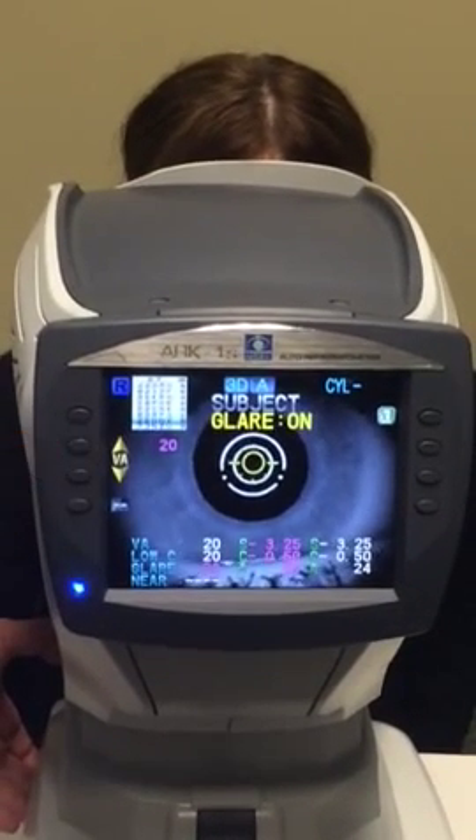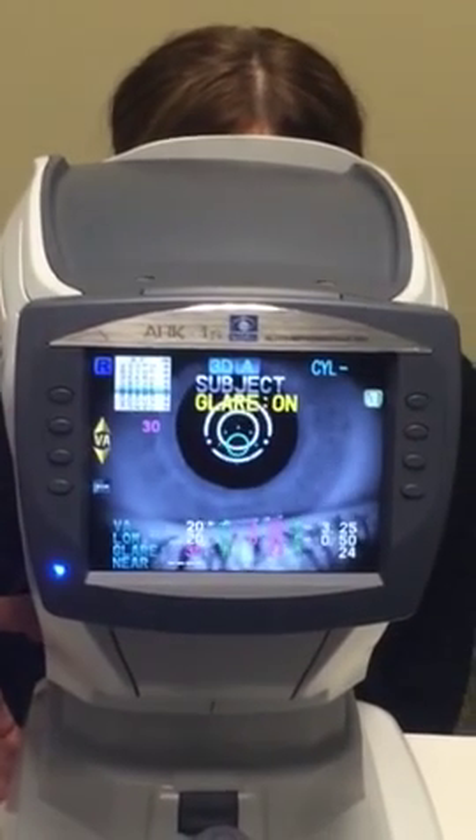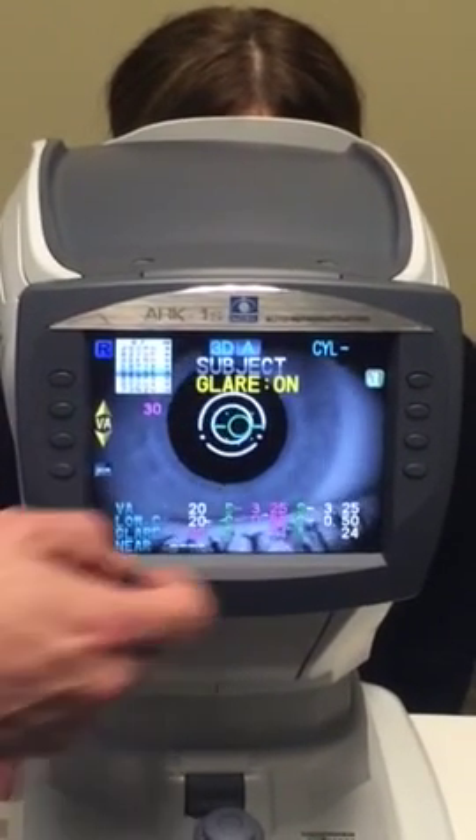Can you read those? No. How about those? No. How about those? R-P-O-I-C. How about those? 6-2-C-N-K. Great. Then let me sit back.